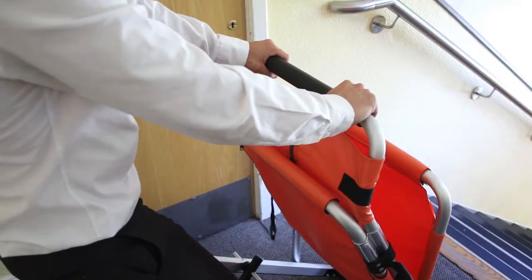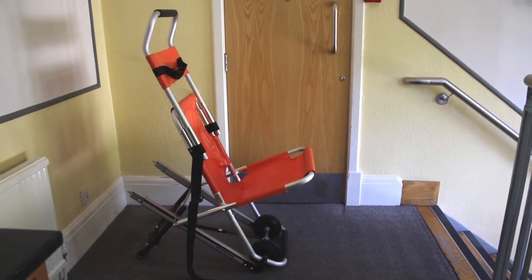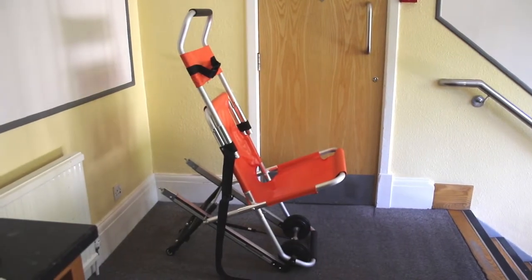Once stable, pull upwards on the handle until the locking pins click into place. Then slide the headrest and strap down into position.